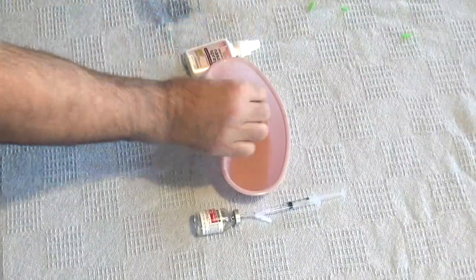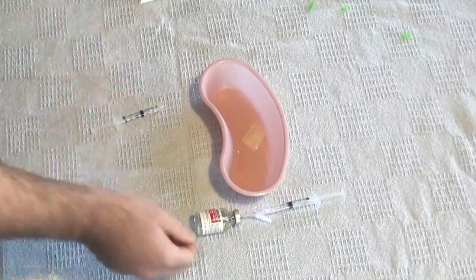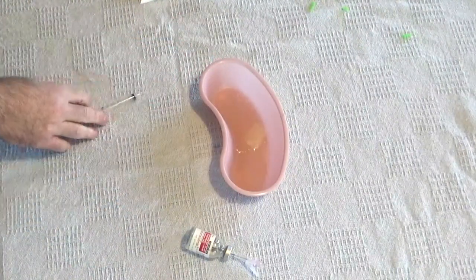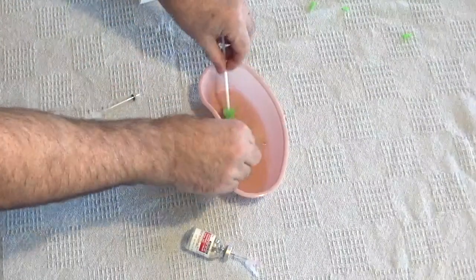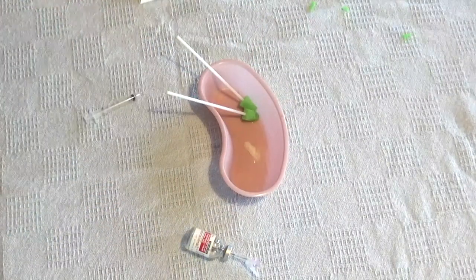Next, take an absorbable hemostatic agent like gel foam or Surgicel, put it in a kidney basin and squirt it a couple of times with some oxymetazoline or phenylephrine nasal spray, a little bit of lidocaine with epinephrine, and if you have it, a little bit of topical tranexamic acid, and then mix it all together with the little green spongy things.